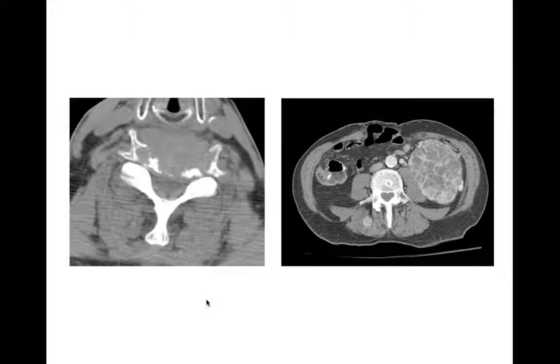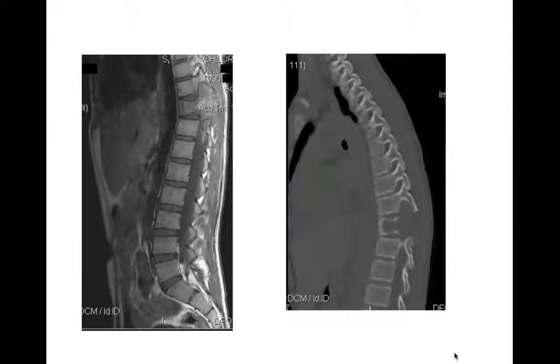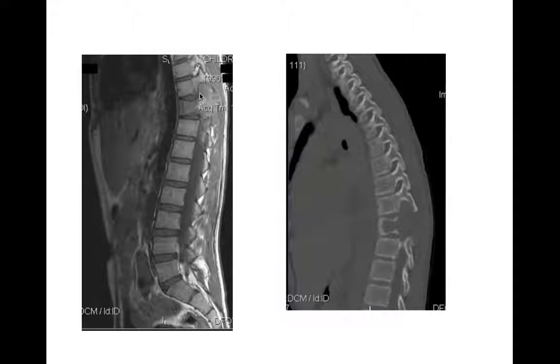For things in the spine: mets and multiple myeloma in an older adult — just think of those because they're so common. Here's another aneurysmal bone cyst extending from the vertebral body into the posterior elements. On sagittal CT and MR it's visible, but on MR you don't see fluid-fluid levels to tip you to ABC or giant cell tumor — yet this one ended up being an aneurysmal bone cyst.